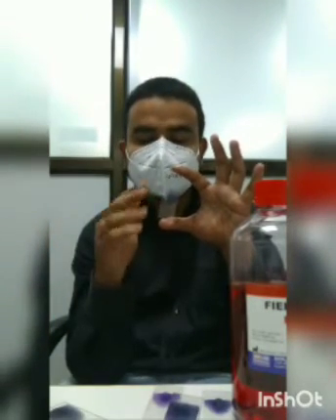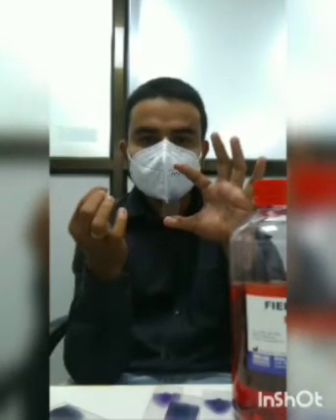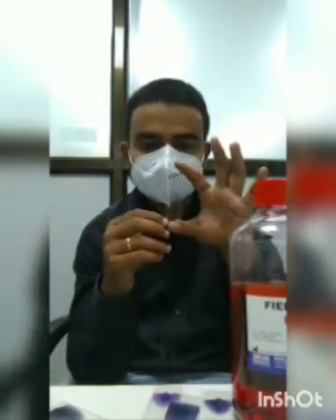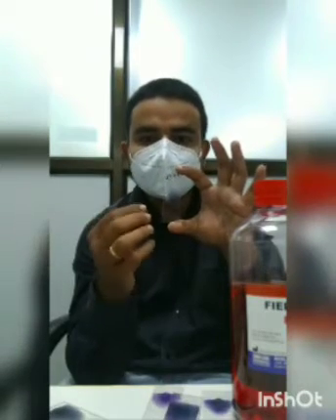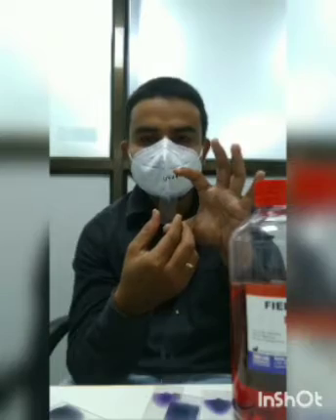So what is happening, all the cell walls are being broken, all the hemoglobin is being washed out. Okay, only the parasites and the nucleus parts of the cells will remain, and all the cytoplasm will get washed off. So we will be able to see the parasite very clearly. Okay, so this is the thick smear.